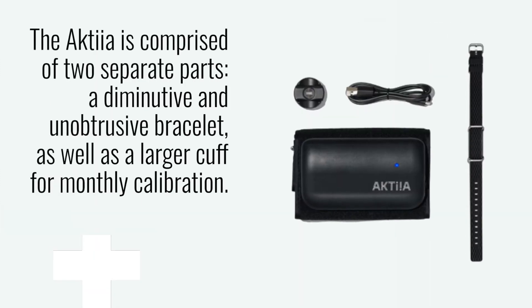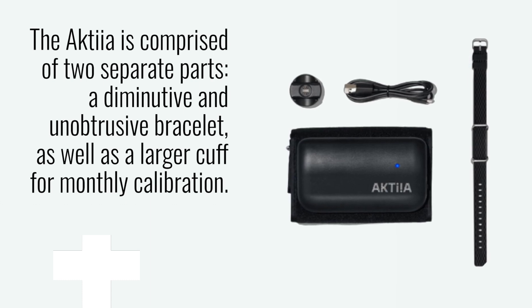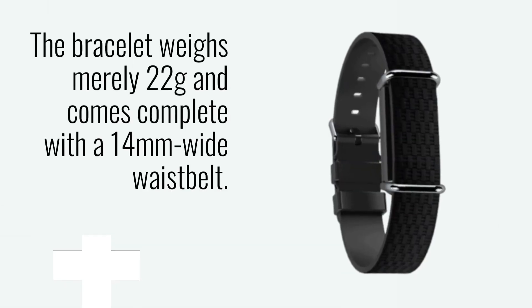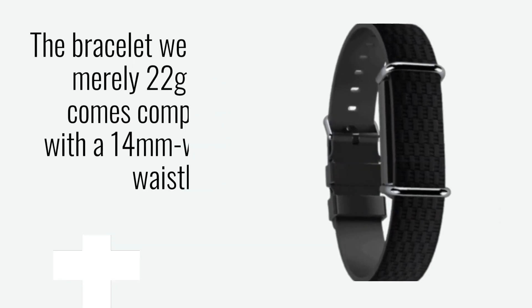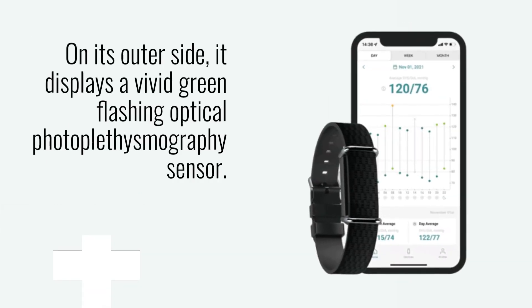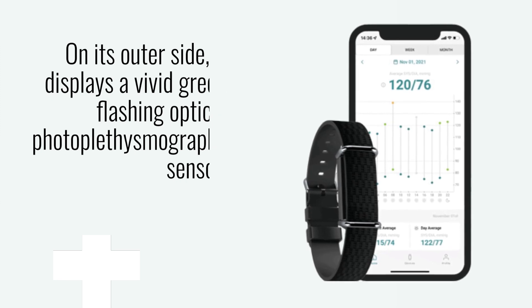The Aktiia is comprised of two separate parts: a diminutive and unobtrusive bracelet, as well as a larger cuff for monthly calibration. The bracelet weighs merely 22 grams and comes complete with a 14mm wide waist belt. On its outer side, it displays a vivid green flashing optical photoplethysmography sensor.